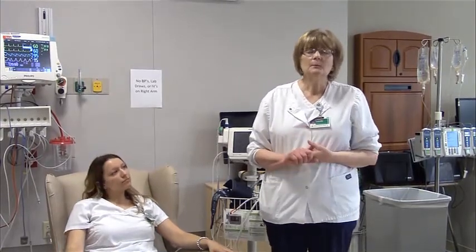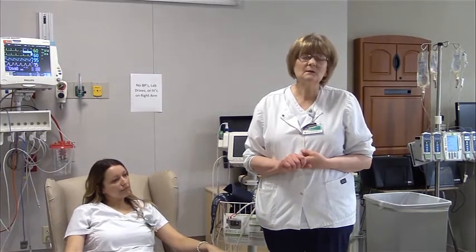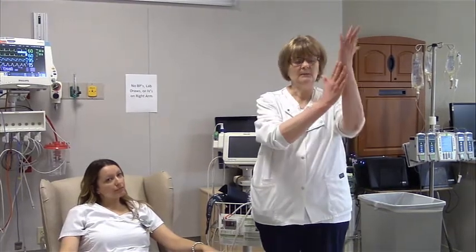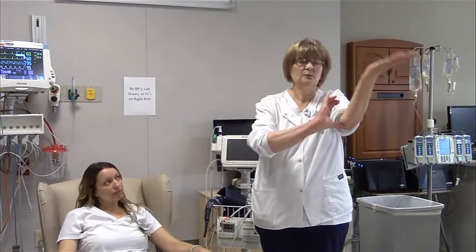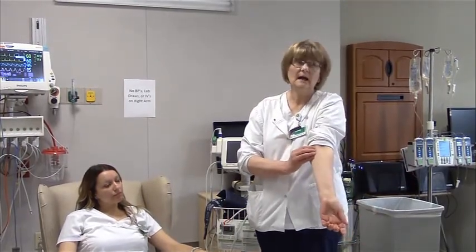The next pulse that I want to talk about is the brachial. You do need to know where this one lives, because this is where you're going to line up your manual blood pressure cuff to know where to place your stethoscope if you want to be able to hear a manual blood pressure. So on the pinky side of your body, you're going to run it up to the elbow. You're going to take your other hand, you're going to put your thumb right in that joint, and you're going to bring your fingers over to the outside.